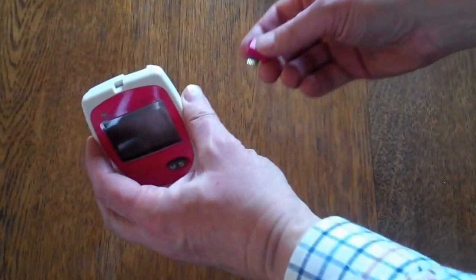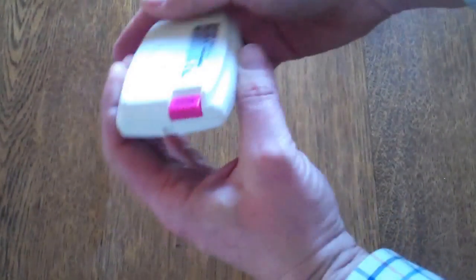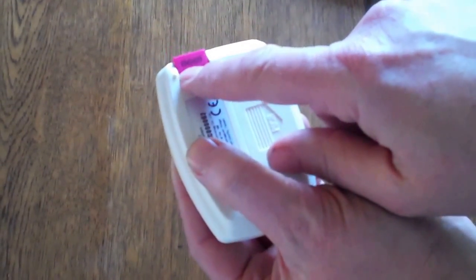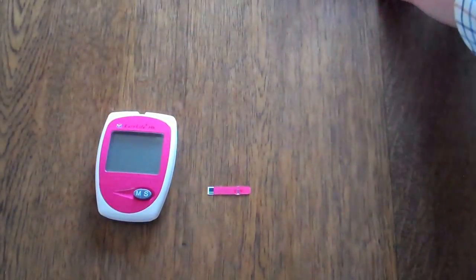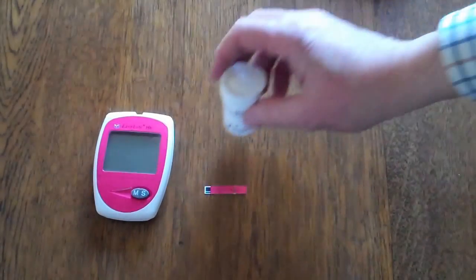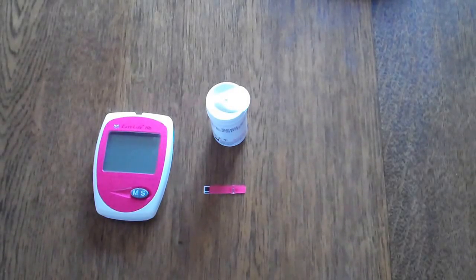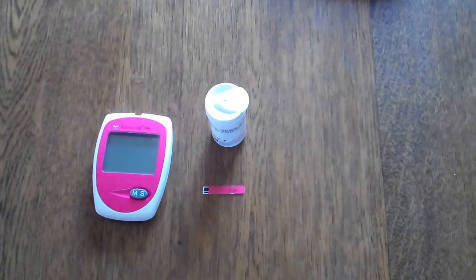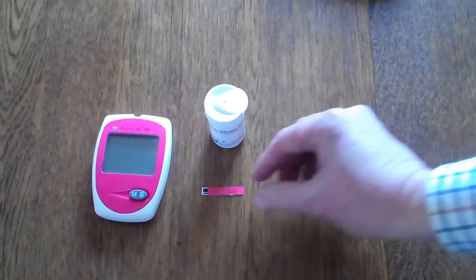When you start a new pack of test strips it's important that you fit the new corresponding code chip. The four-digit code for the test strips is printed on the back of the code chip, and this must correspond with the coding shown on the test strip pack. The code chip effectively calibrates the meter for that batch of test strips, so it's very important that the code chip is changed with each new batch or vial of test strips purchased.